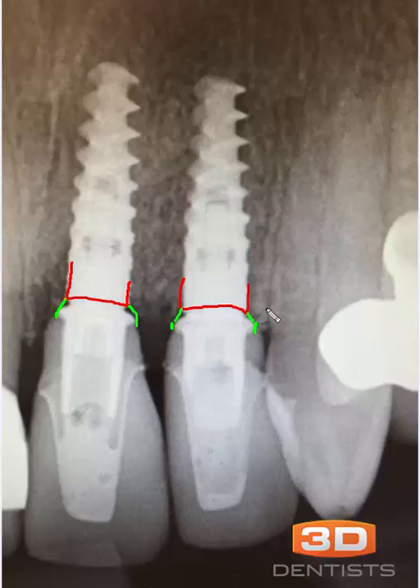That's not terribly unusual. What I'm more concerned about is the distance between the head of the implant and where it gets so wide — right here. It's not that it necessarily gets wider; it's how soon it becomes wider. This doesn't matter so much on posterior implants or wider implants, because then it's as wide as the implant itself. But it really becomes an issue on anterior implants.